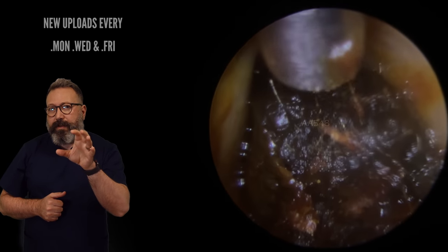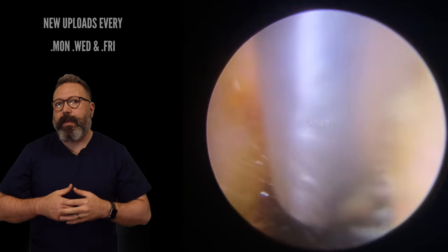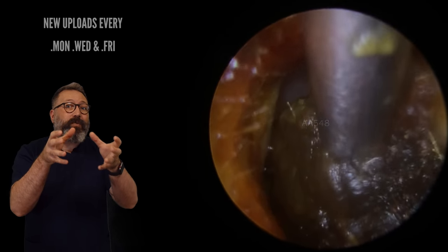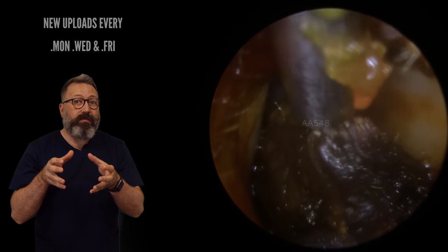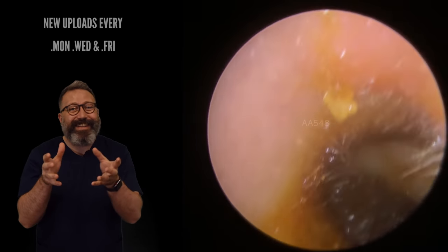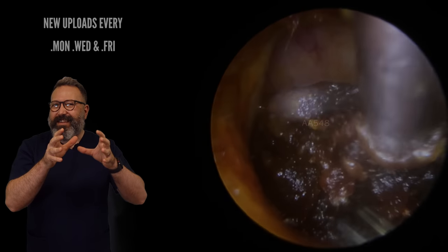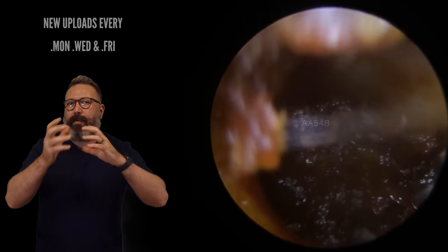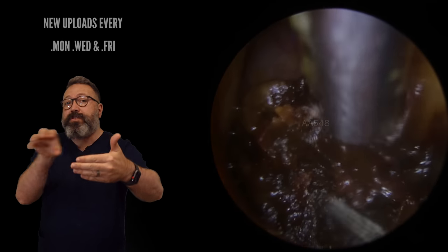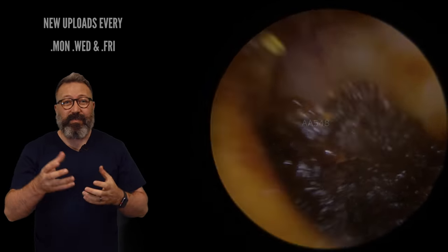There's a little bit of movement. So we're going to hold on to the top and draw — we're going to work with this. We've drawn this down and we're going to start rolling this wax down the ear canal now. Now we're getting a bit of movement. The key now is can we get this out without it sticking again to the canal walls on the outside edge? Is it going to roll? It started to roll down. I think this is going to break, guys — look at how that front is really mobile. What I always do when I'm looking at this kind of wax is look at what the suction tube is actually working on, and then look at what the wax behind is doing. If you're getting loads of movement at the front but the back is barely moving, then this is going to detach and break away easily — which is what happened here. So we've got that surface layer away, and we've got this tougher back layer.